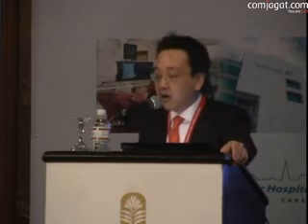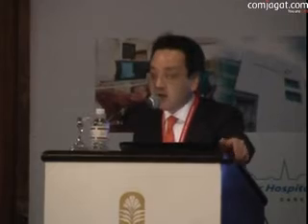So the summary of the second generation everolimus stent is that it has better efficacy than Taxus, similar efficacy with Cypher, and a significantly lower rate of myocardial infarction and stent thrombosis compared to Taxus in the meta-analysis. However, there is no difference in death and TLR, but a definite trend for lower MI and stent thrombosis rates compared to Cypher in the meta-analysis. However, some of these data are only up to 1 year, so we need more data and long-term follow-up to confirm the safety of everolimus.